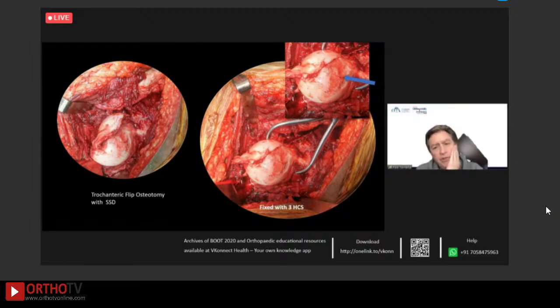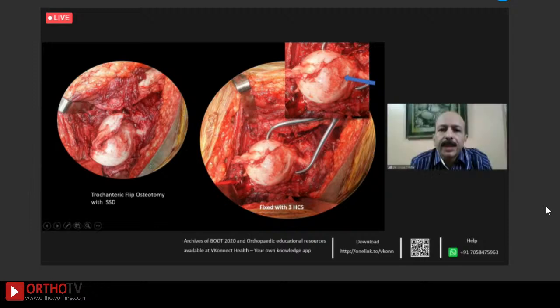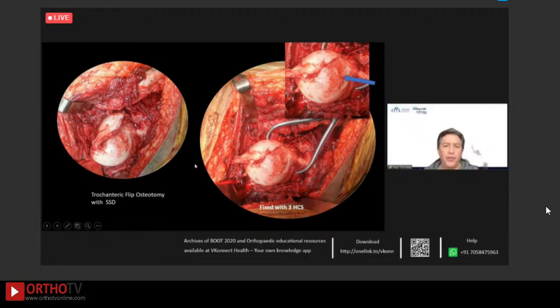This looks like it's not quite reaching the roof, although it's hard for me to get the orientation without being there, but it seems like the roof is more to the left of the interior, right? So that area looks pretty good to me. If it's in the roof, you've got a really big issue and then you may consider it. But if it's more on the side of the head, I wouldn't be too aggressive at that point. But I can't say that I have a lot of experience to say that's the right answer.